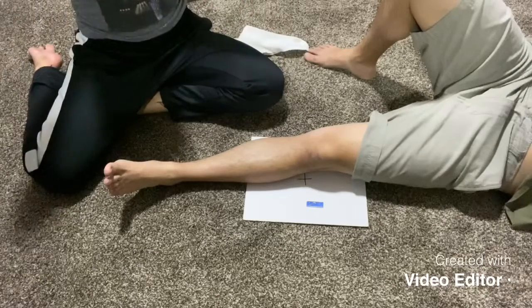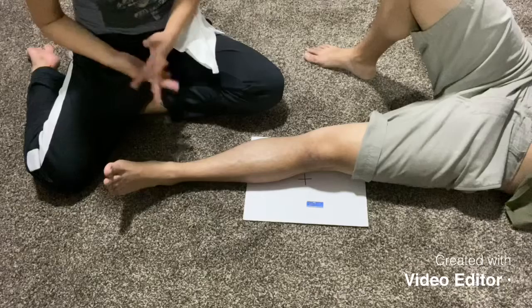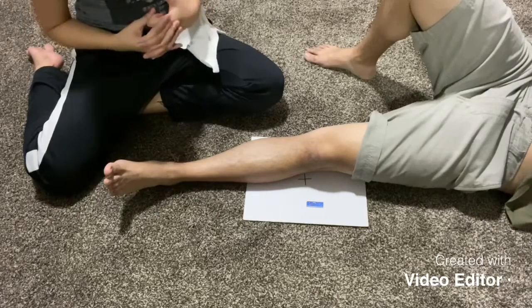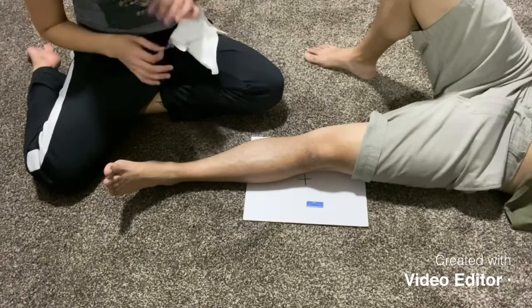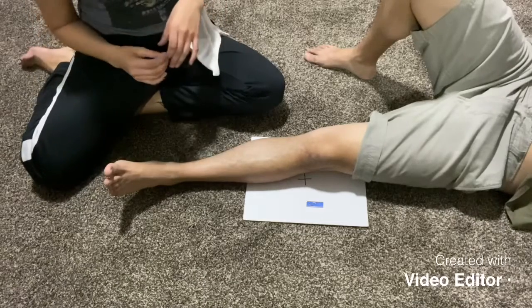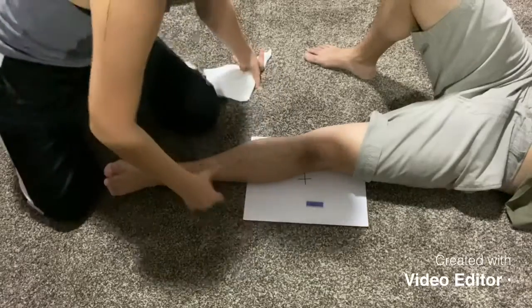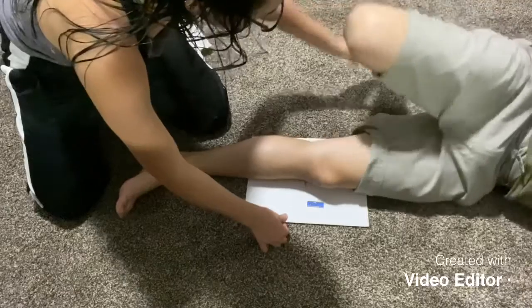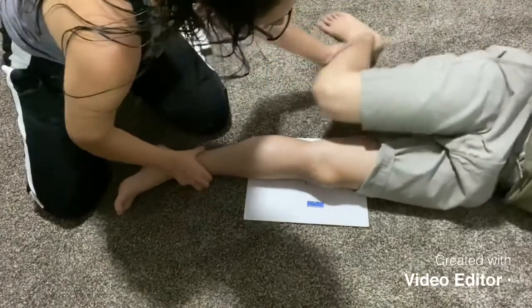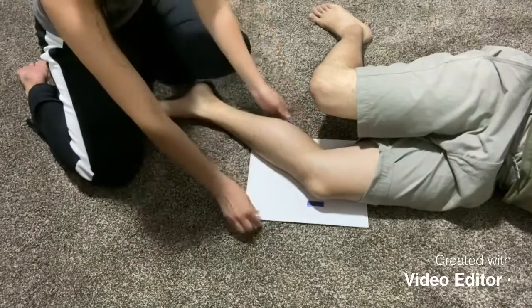Lastly is our lateral knee. Same size of cassette, using a 10x12 cassette, 40-inch SID tabletop. The angulation on this one is going to be 5 to 7 degrees cephalad towards the patient's head. We'll rotate laterally for this exam, and you can bend your knee. Bend this knee 25 to 30 degrees.